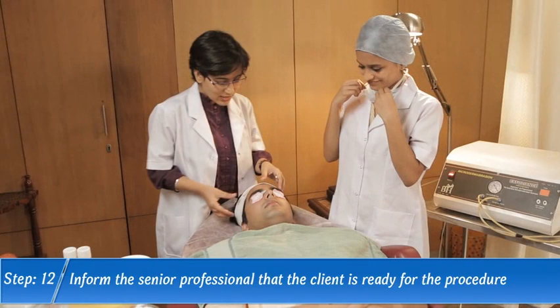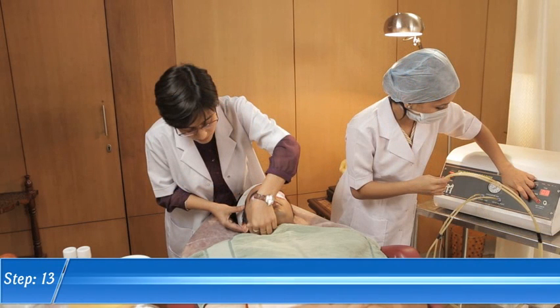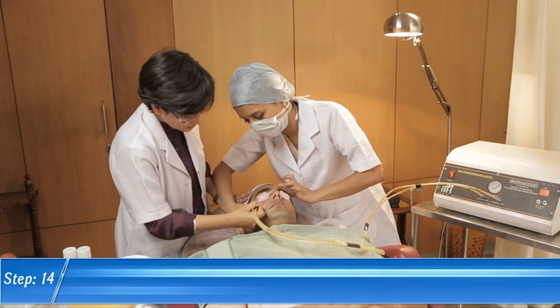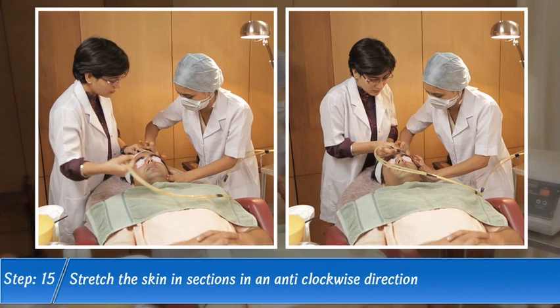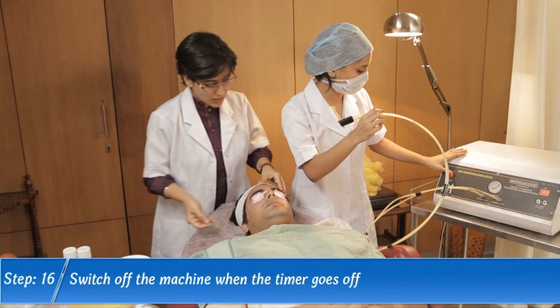Step 12. Inform the senior professional that the client is ready for the procedure. Step 13. Switch on the machine and set the timer as directed by the senior professional. Step 14. Make the client comfortable and assist the senior professional by stretching the skin. Step 15. Stretch the skin in sections in an anti-clockwise direction.